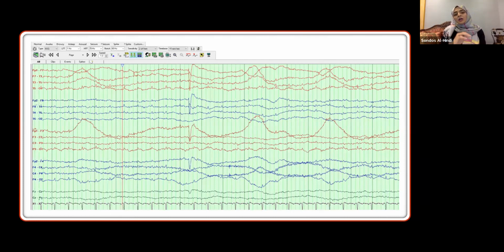And if I put it on a brain death montage, it would fulfill the criteria. But on clinical examination, the patient was not completely fulfilling the criteria. He had some sluggish reaction. On a repeat examination a few days later, he fulfilled the criteria and was declared brain dead. The issue with this patient, again, as we talked about, is having a cardiac arrest and severe anoxia. We couldn't get an MRI on him, but he probably had cortical infarct or necrosis due to severe hypoxia and a prolonged resuscitation. Of course, why this 34-year-old gentleman had a cardiac arrest was a different story.